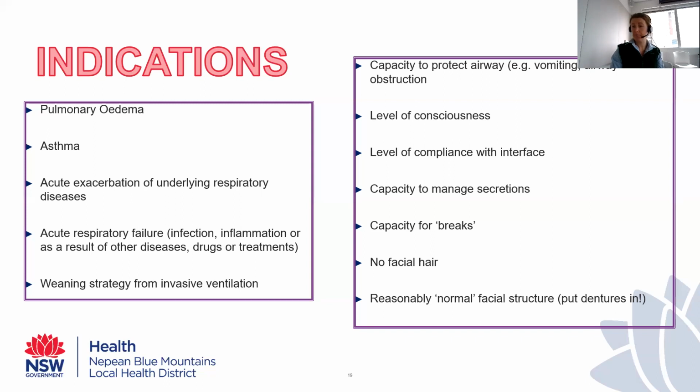Absolutely, for the first, I'm going to say, couple of hours, even first 2 to 3 hours, yes, the patient needs to go on that therapy and not take a break, because we're trying to get it established. We're trying to get those alveoli nice and open. We're trying to get oxygenation improved, and that therapy needs time to work. But after that, they should be able to have reasonably regular breaks.